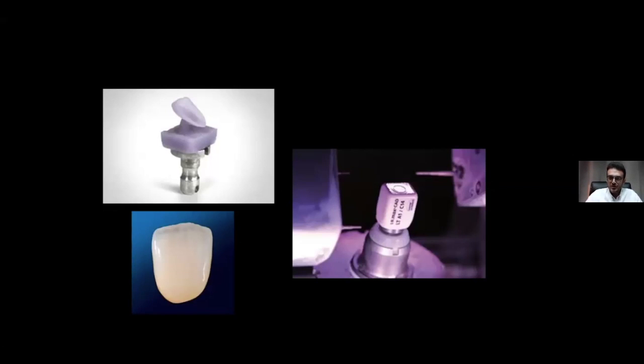So you cannot just press the software button, next, and the CAD-CAM will do your job. You have to choose, you have to modify, and at some point, a part of the job you have to do yourself. Since you are using the CAD-CAM machine at your office, there is no lab that you are going to communicate with. So you are now the dentist in the lab, or as I like to call it, a prosthodontist ceramist or a dentist ceramist. You have to do all the job from A to Z by yourself.